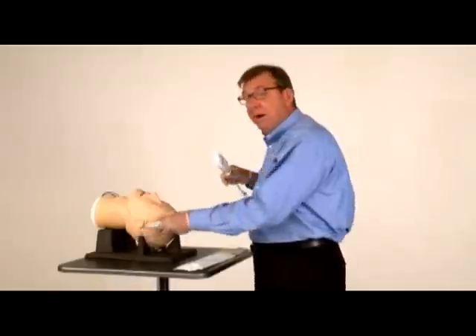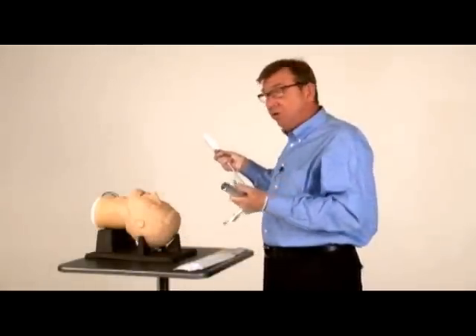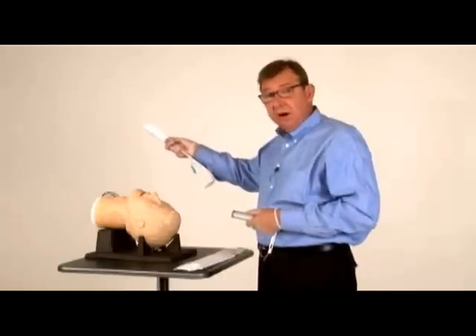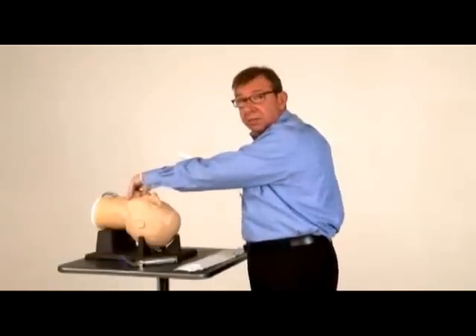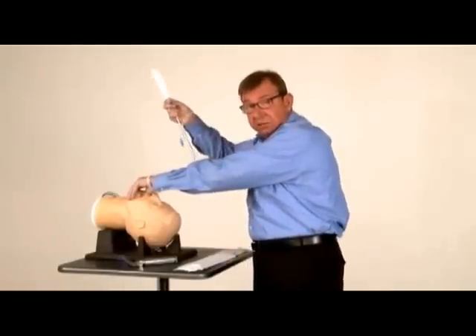There are two different methods for using the ViewStick. One is much like your regular laryngoscopy technique — you use a laryngoscope in your left hand and the stylet and tube in your right. The second method is to grab the lower jaw and tongue, pulling this out of the way a little bit so that you can more easily pass the stylet and tube through the cords.